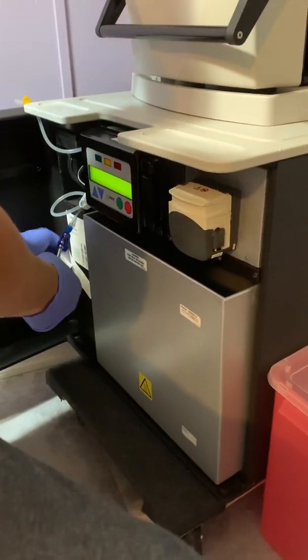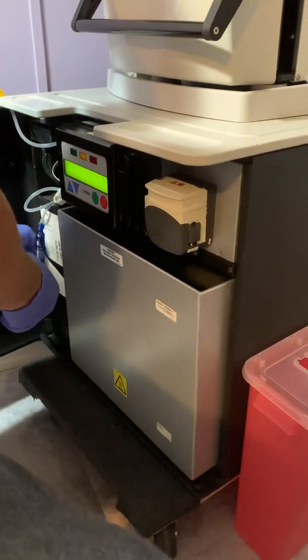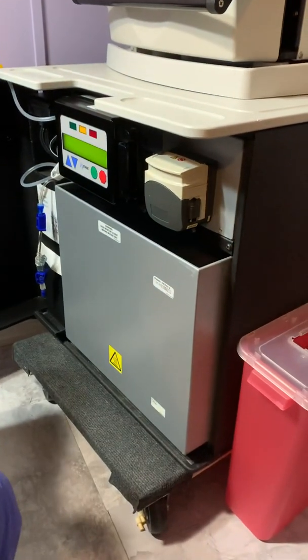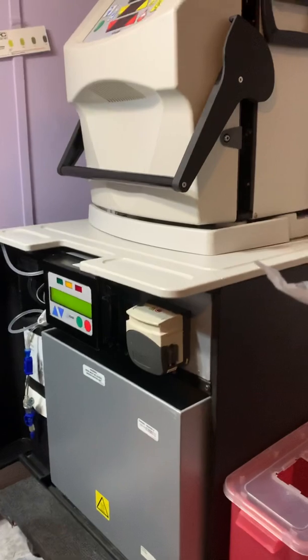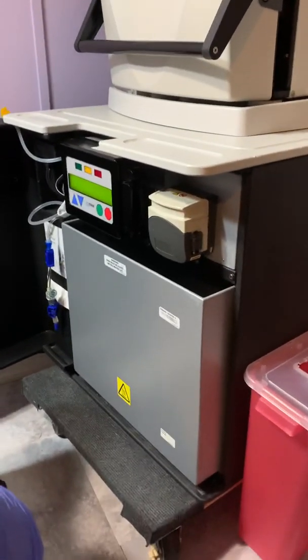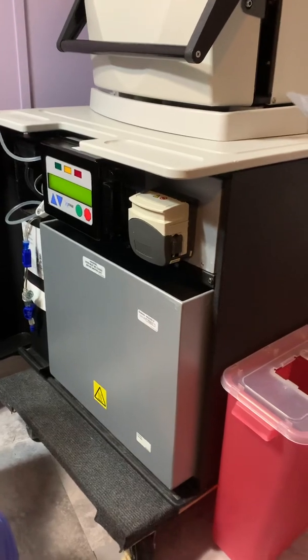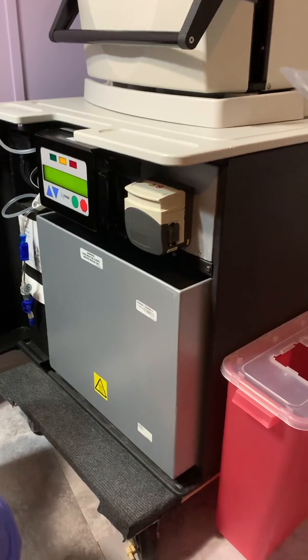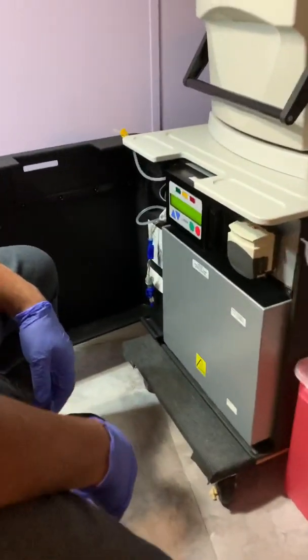Hey everyone, today we are setting up a new sack in our PureFlow for our next stage dialysis system. I have not done a video of removing the sack yet — we will do that when we remove this sack. But Casey is going to set up this sack today.